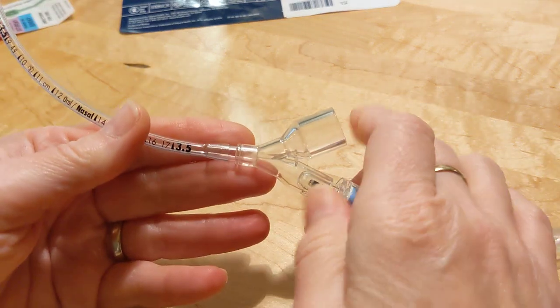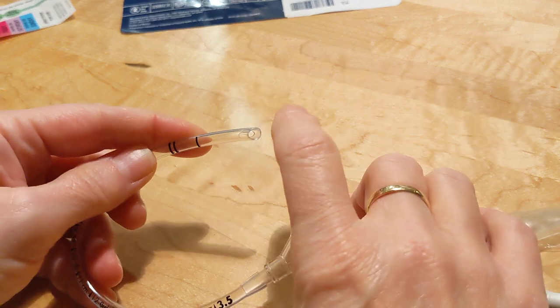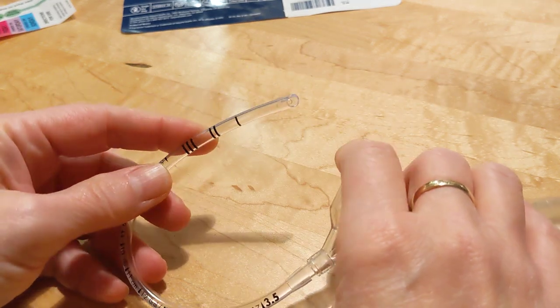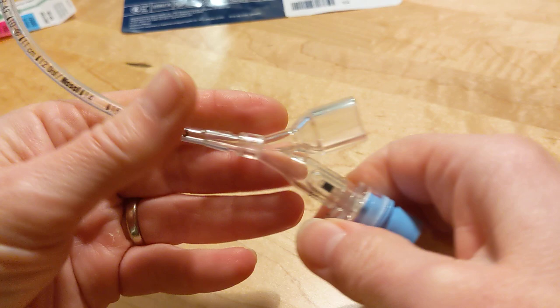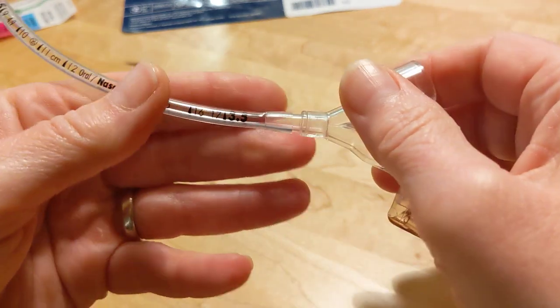So how do we figure out how far to go down with the suction catheter in order to not go past the end of the ET tube and cause damage to the trachea and the carina? The easiest way to do that is to figure out what number the end of this Y piece is at inside the ET tube.